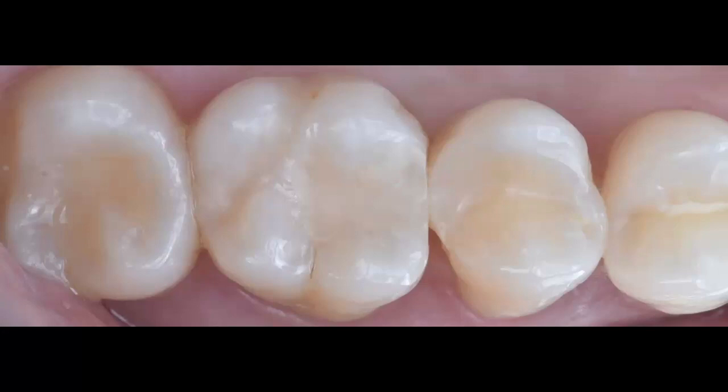And not only is the contact area, or the contact point, not ideal, but I want you to compare the buccal embrasure between 13 and 14 with the lingual embrasure between the same teeth. Then compare it to the buccal embrasure between 12 and 13 and the buccal embrasure between 14 and 15. As you can see, the buccal embrasure between 13 and 14 is completely different, much wider, allowing food impaction, food collection, and gingival irritation. That's the reason why this patient presented to our practice.